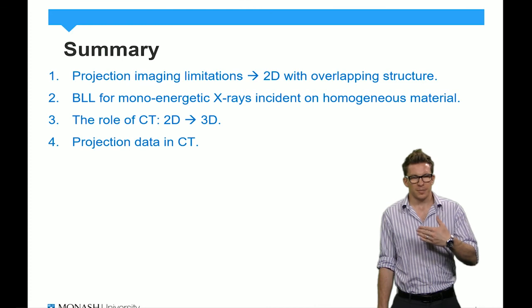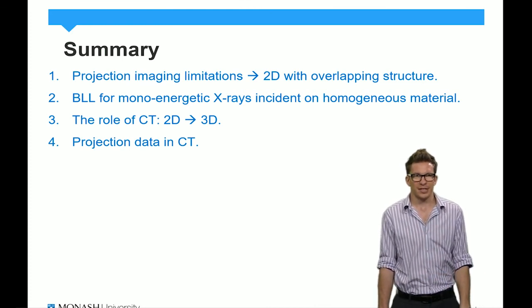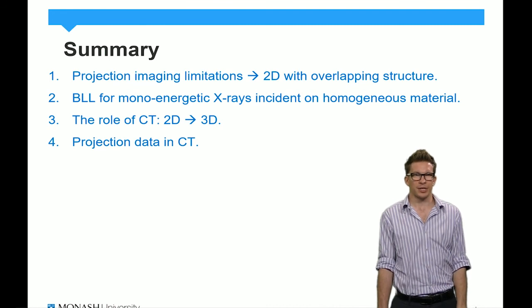And then we've explained how our discussion of volumetric data evolves from 2D projection to 3D projection data, and the fact that we need a reconstruction step. And that brings us to a close.